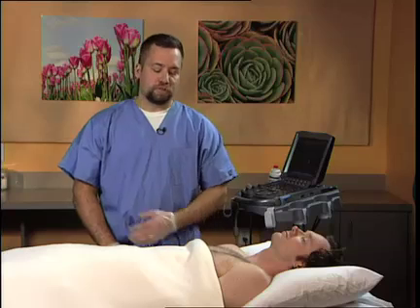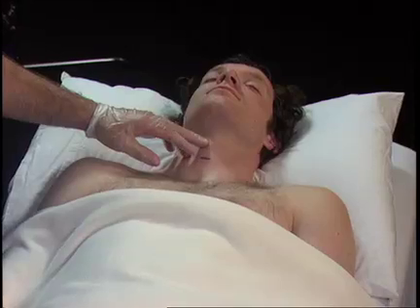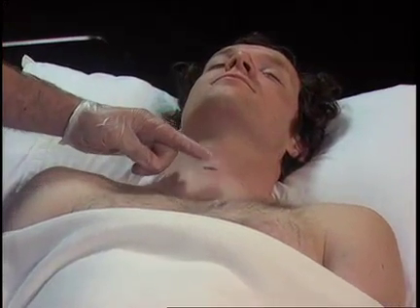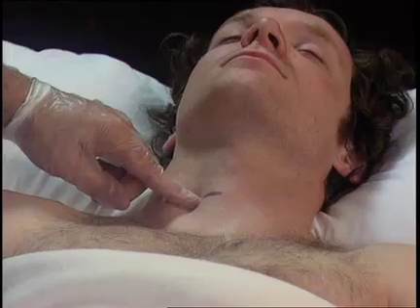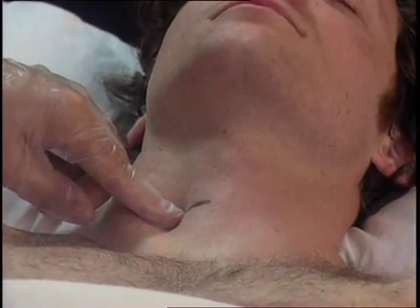The procedure is performed with the patient in the supine position with the chin up, and the following anatomic structures are identified: the thyroid cartilage, the cricoid cartilage, and then the finger is placed in the groove next to the trachea and pressure applied until a bony protuberance is felt. This is Chasniac's tubercle or the transverse process of C6.